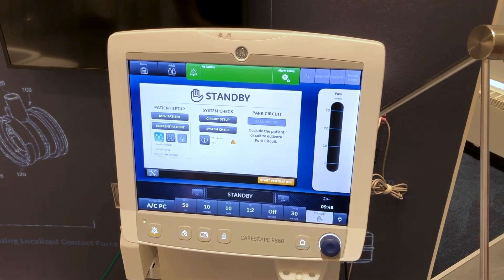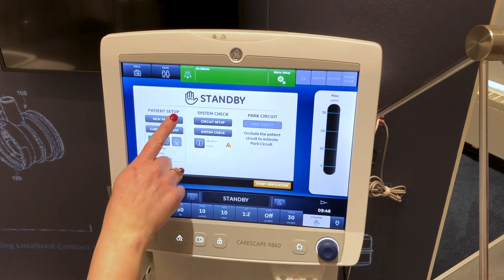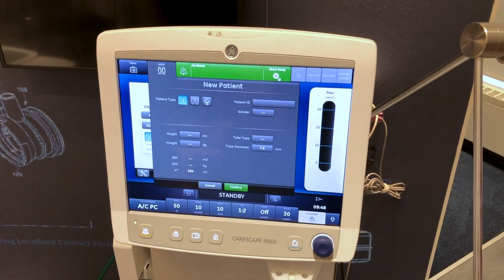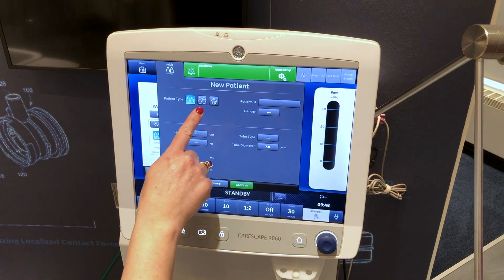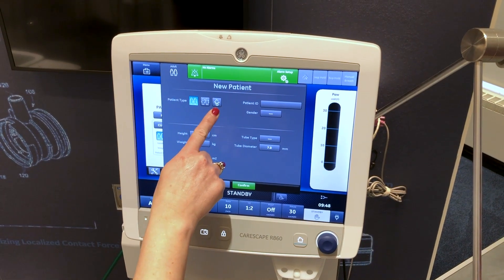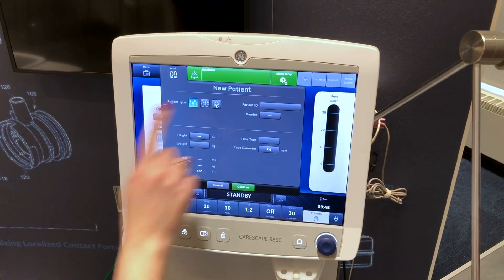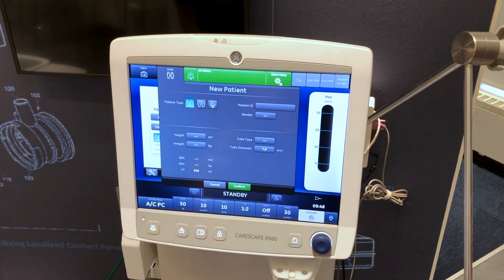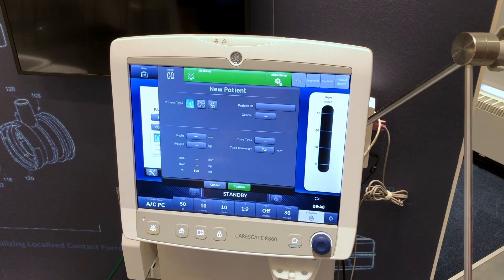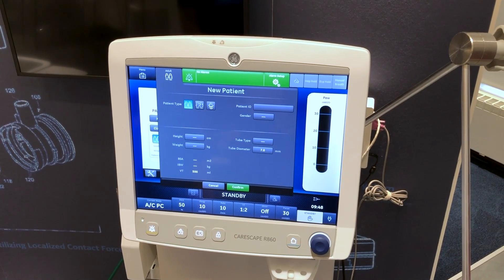Select new patient, then select adult, pediatric, or neonatal patient type. When selecting neonatal, a neonatal flow sensor is recommended.